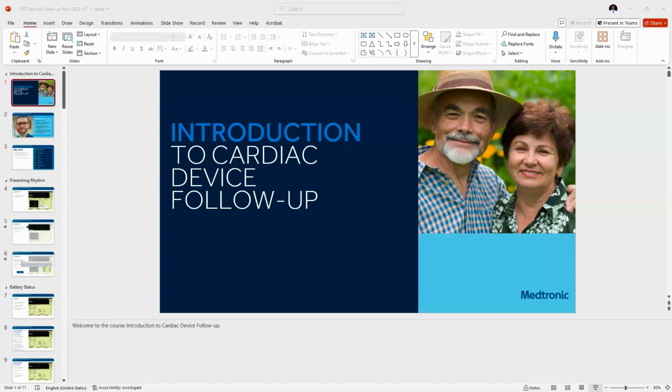So this is the VV delay. Here you're able to program the time interval, and it allows you to program between 0 to 80 milliseconds. At the same time, our device has an algorithm, the CardioSync algorithm, that allows you to test and see what's the possible VV delay and the AV delay of your patient, and you're able to customize your programming to this particular patient. But the recommended, the best approach for achieving synchrony is through echo optimization.